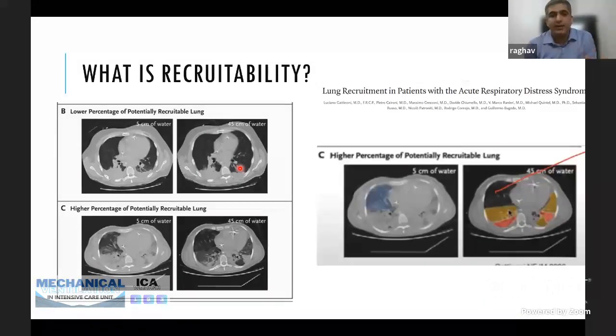But what else has the PEEP caused? You can see the heart in this picture, on the left and on the right. You compare. The heart is completely compressed with these high pressures. This was because the lungs were hyperinflated, they exerted pressure on the heart and it got compressed. So what will this lead to? This will lead to a decrease in preload and hypotension with no benefit of PEEP. And in such patients, low PEEP should be applied.